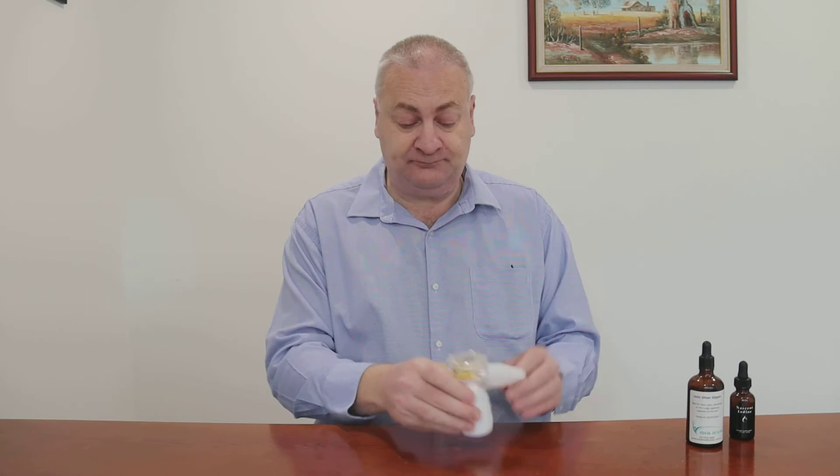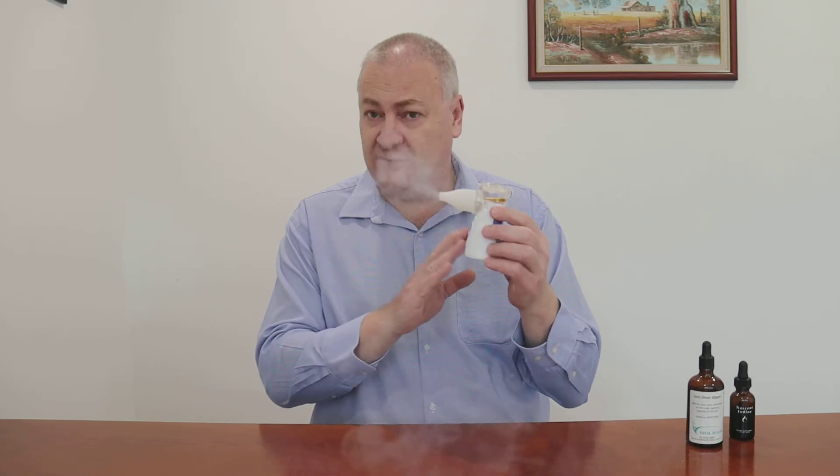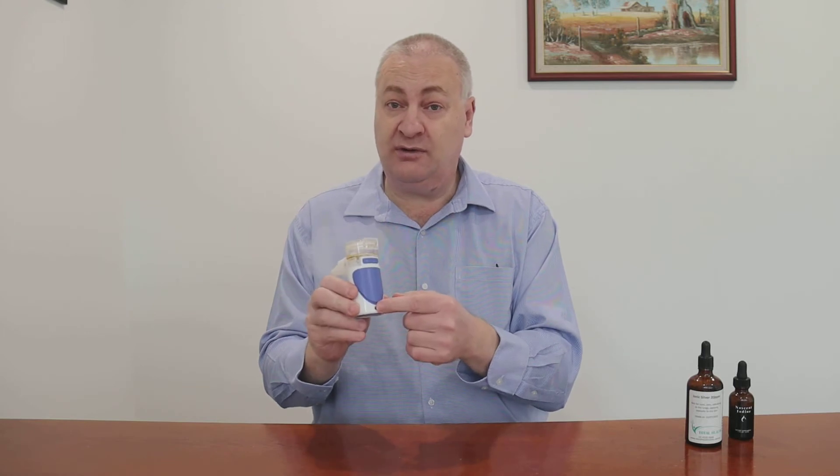Close the cap and start nebulizing. You'll notice — I don't know if you can hear this on the video — but there should be a bit of a hiss coming out of the nebulizer when you use it. Sometimes it will still work and you'll get a smaller amount of vapor coming out but no hiss, and what that means is that your batteries are running low. You can run this off two AA batteries in the base, or you can plug it in with the cable supplied into an ordinary USB port.